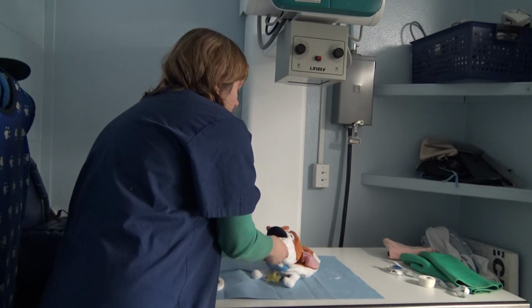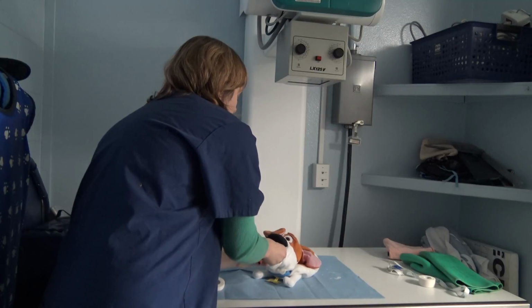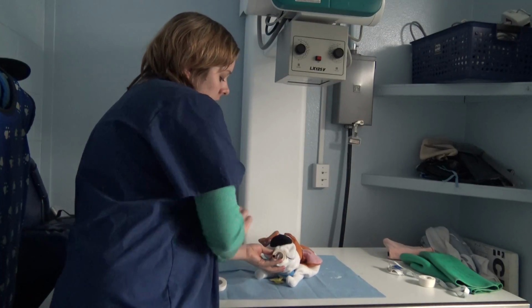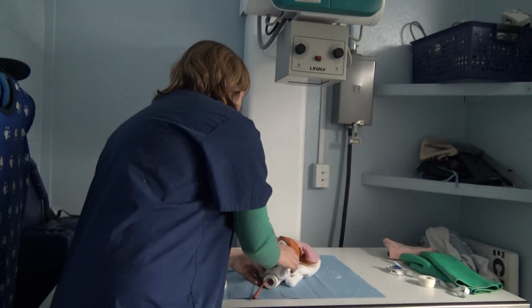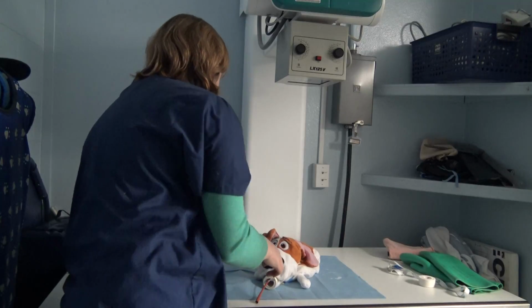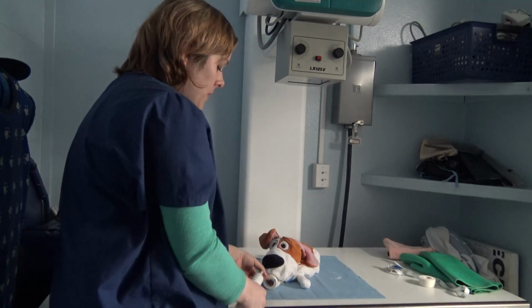And with a real patient, you shouldn't get much resistance. And we're going to go down to where we taped. So now we have it taped off here. Depending on the syringe you're using, sometimes you can cut it off at that point. Ours have the big tips that will actually work better in the end.